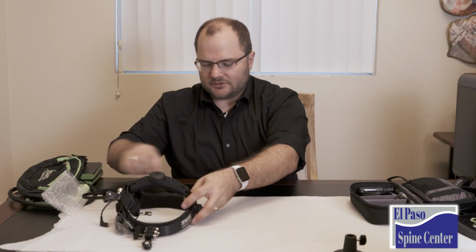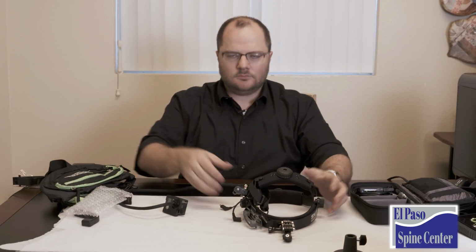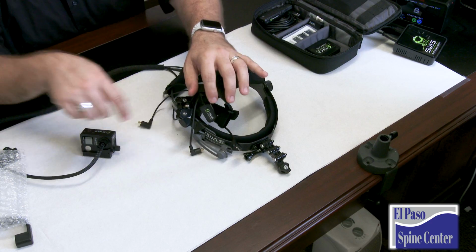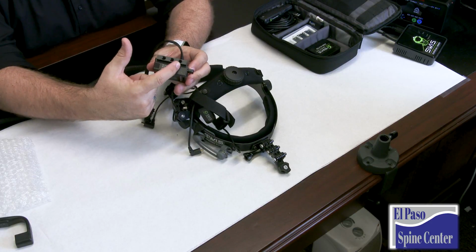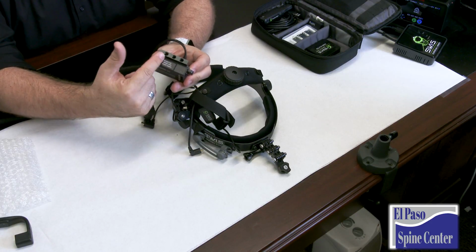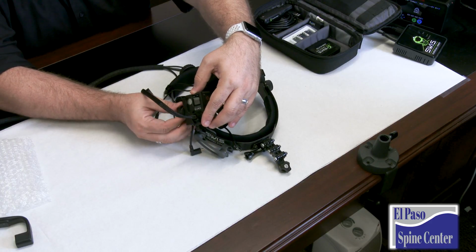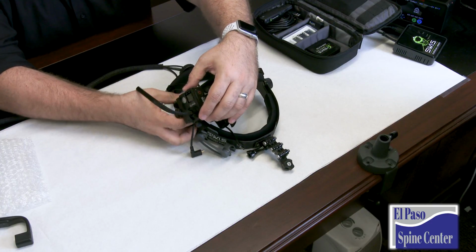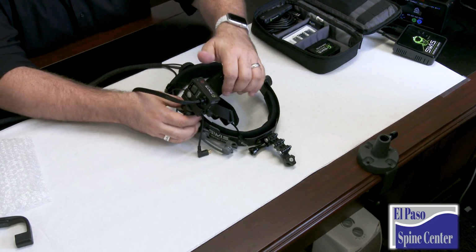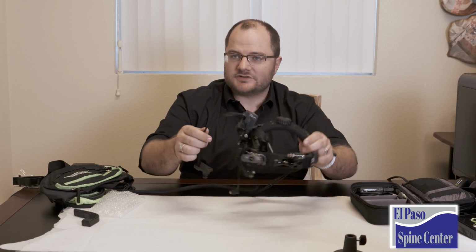Now, let's go into how we set up our headgear and how we're actually going to be using this to record. The first thing I want you to do is take your GoPro. You're going to notice there is a place with 3 different attachment points. All we're going to do is take that and we're going to screw that into the side headgear GoPro mount on the system. And that will just sit right there. It's pretty secure. It's not going to go anywhere.